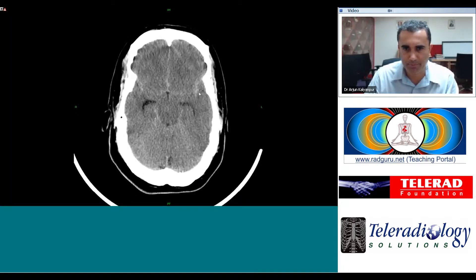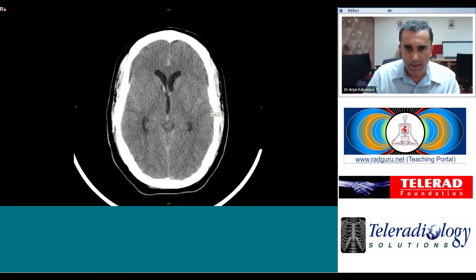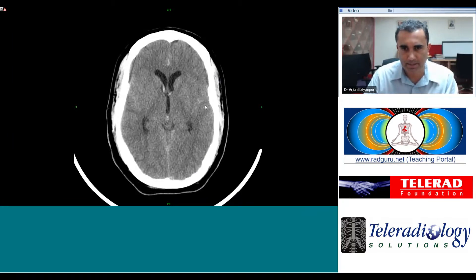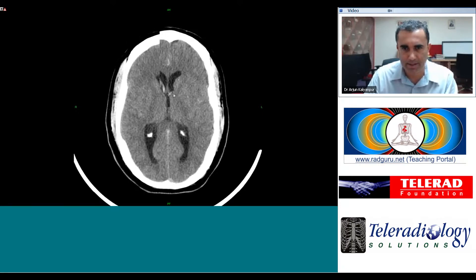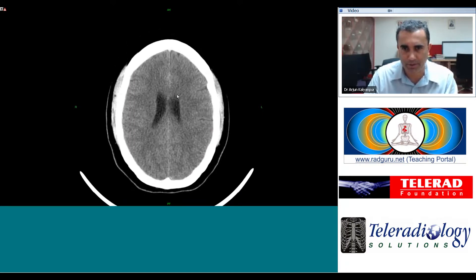The basal cisterns look somewhat full. As we scroll more cephalad, we see that the ventricles are mildly dilated and there is high density material in the frontal horns of the lateral ventricles. The sulci overall look a little bit tight.